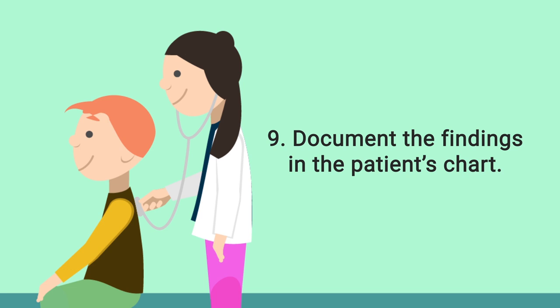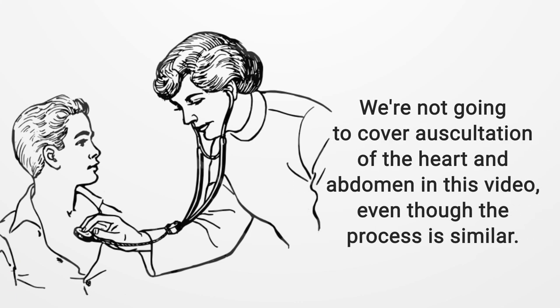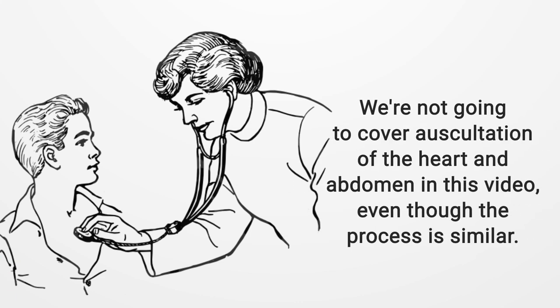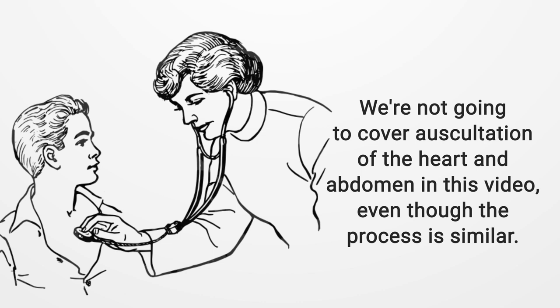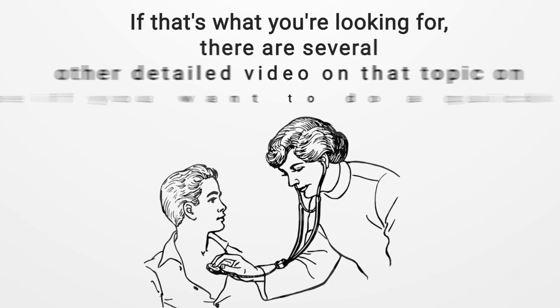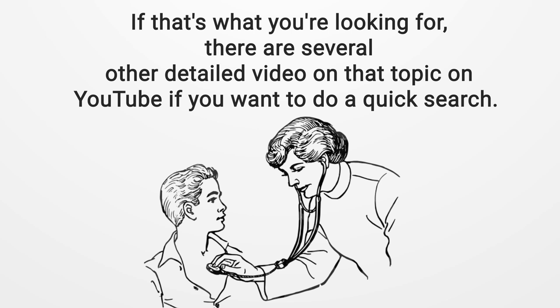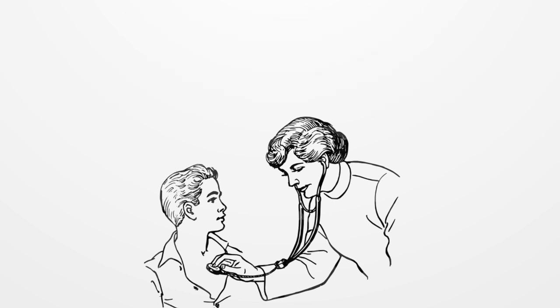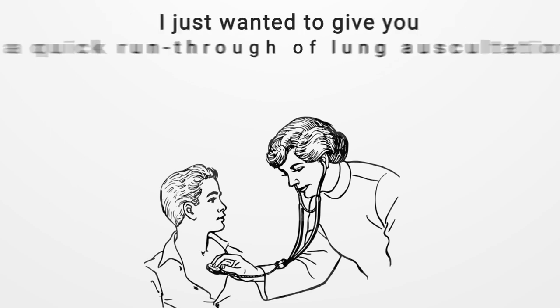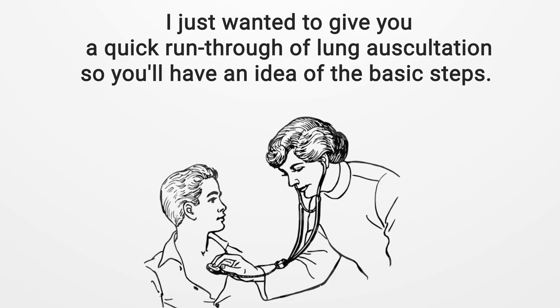Since this is a respiratory therapy channel, we're not going to cover auscultation of the heart and abdomen in this video, even though the process is very similar. There are several detailed videos on that topic on YouTube. I just wanted to give you a quick runthrough of lung auscultation so you'd have an idea of the basic steps.